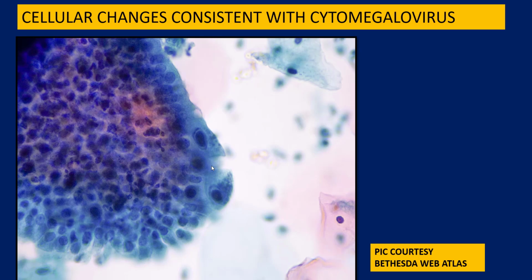This is a picture from the Bethesda Web Atlas. I've actually never really seen this during my practice. It may be found in immunocompromised women. The presence of changes related to cytomegalovirus on cervical smears. You can see this large cell inclusion over here.